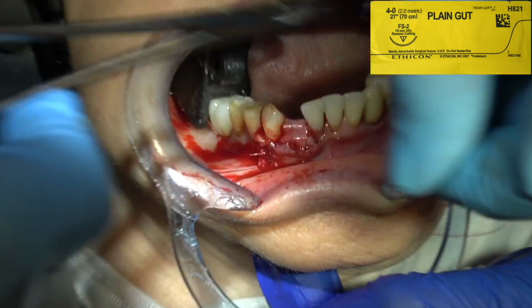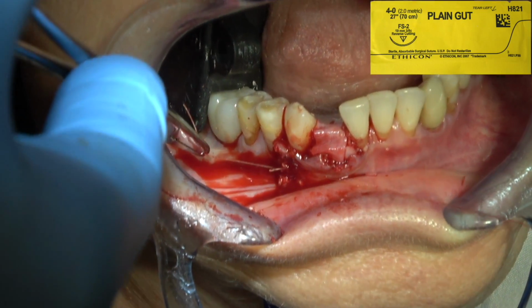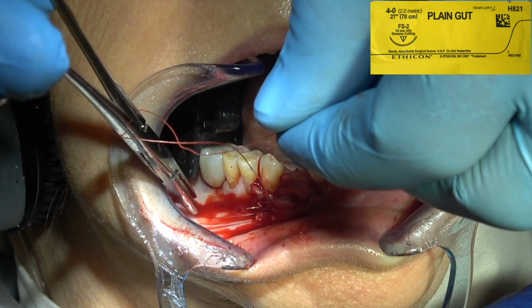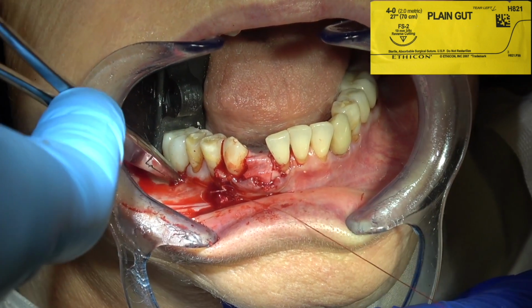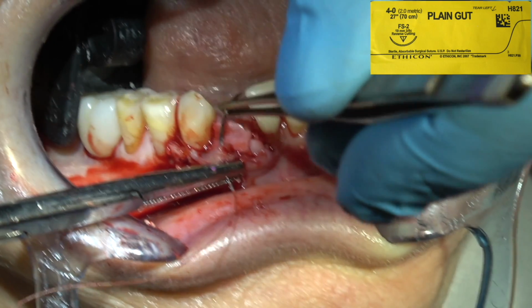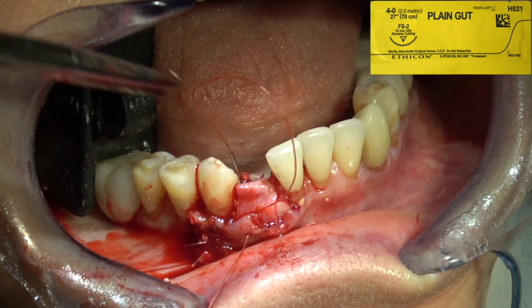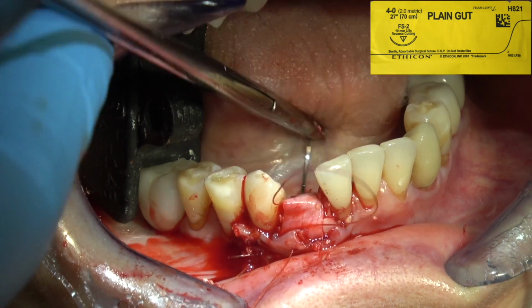So I'm going to cover as much of the graft site and the resorbable collagen membrane as I can, but I'm not going to reflect all this tissue and all the releasing incisions to try to cover the whole thing, because in my 40-plus years of doing this, it heals just fine as long as you've got a resorbable collagen membrane or a slab of platelet-rich fibrin over the graft site.